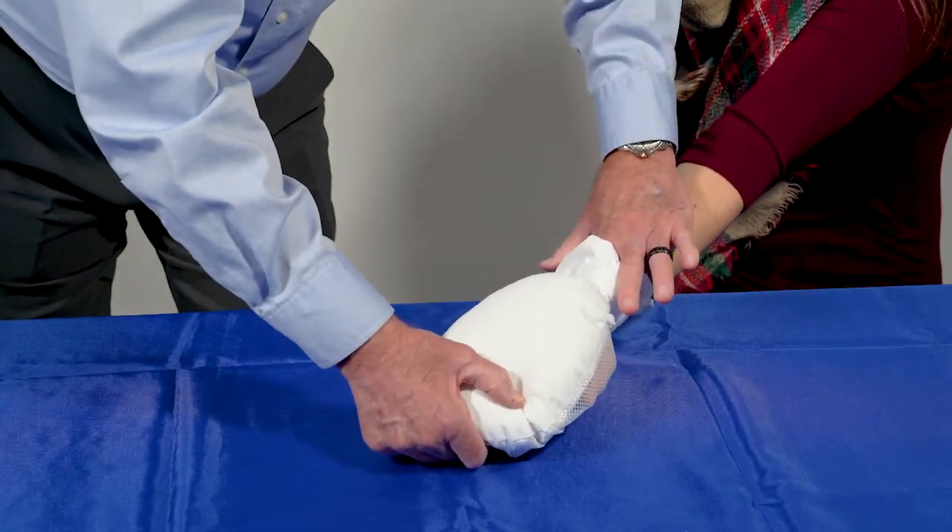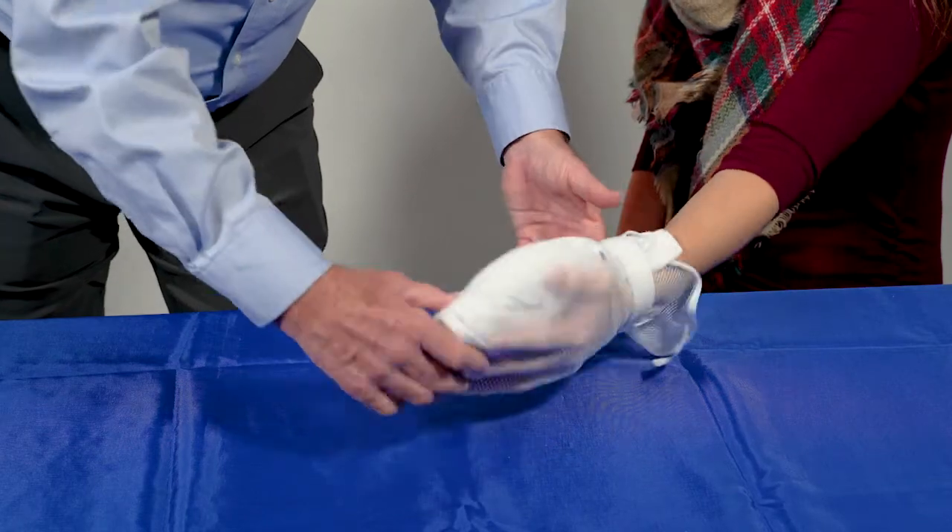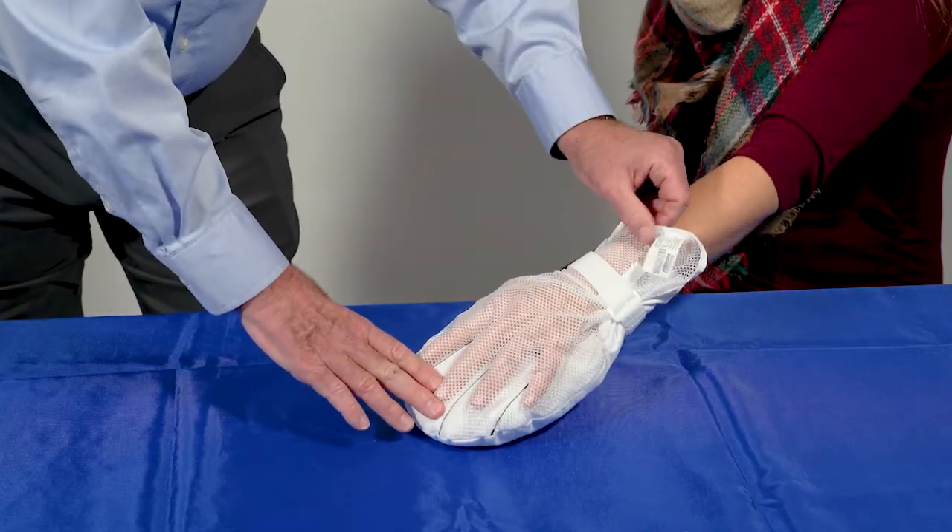Slide one finger flat between the cuff and the inside of the patient's wrist to assure a proper fit. The strap must fit properly.